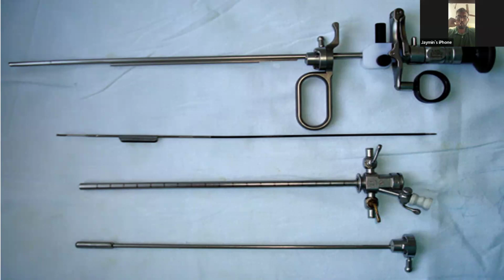Yes, sir. That patient plate will be placed in case of a monopolar, sir.